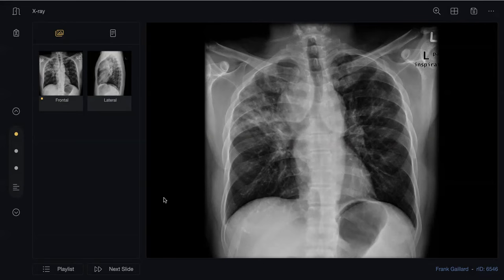How will the biopsy be done? In the lymphadenopathy, they can access through the endobronchial approach. Yes, endobronchial ultrasound-guided biopsy. And what will the biopsy show? Non-caseating granulomas. Okay, good.